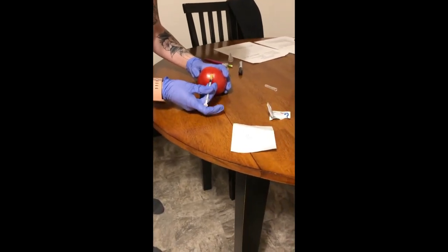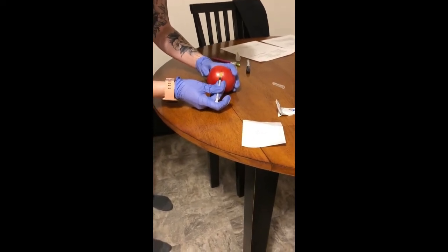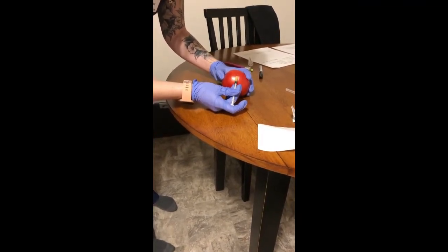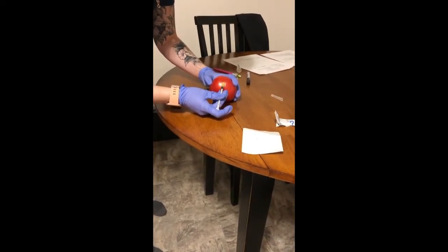You're going to insert, and you want a bleb or a wheal to appear about 1/4 an inch in diameter, which my tomato is not making a bleb, but that's what you would normally look for.